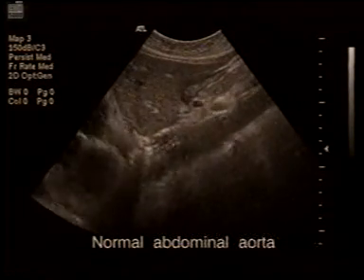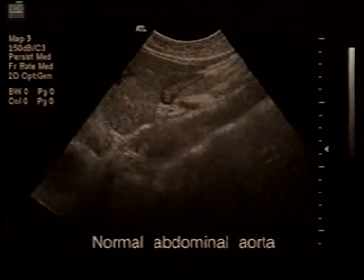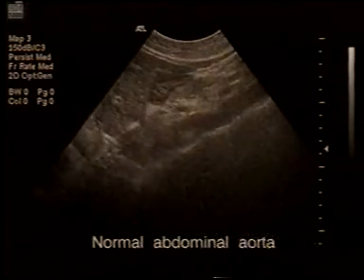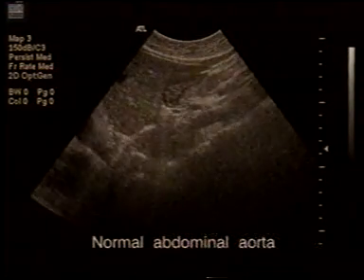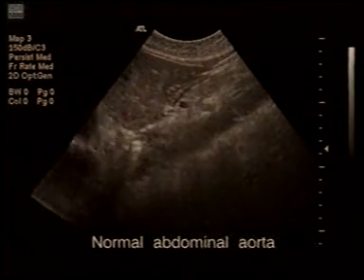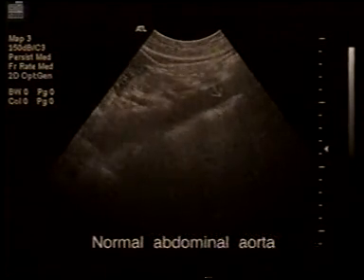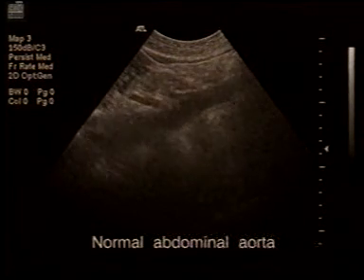First of all, there's a celiac branch coming off here, and a little bit lower down here is a superior mesenteric artery coming off here. And if we wanted to measure the aorta, it's important we measure the walls as well. We measure it superiorly, we measure it in the middle, and we measure it towards the bifurcation, and this is usually where the aneurysms occur. As we get down, we're running into a little gas, so I'm pressing quite hard now. And I'm going to freeze this.